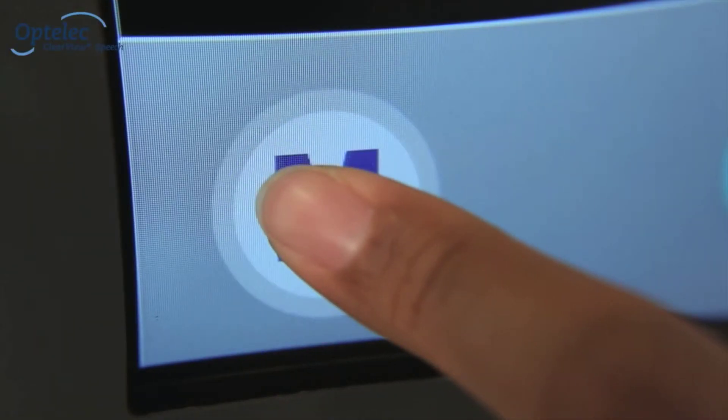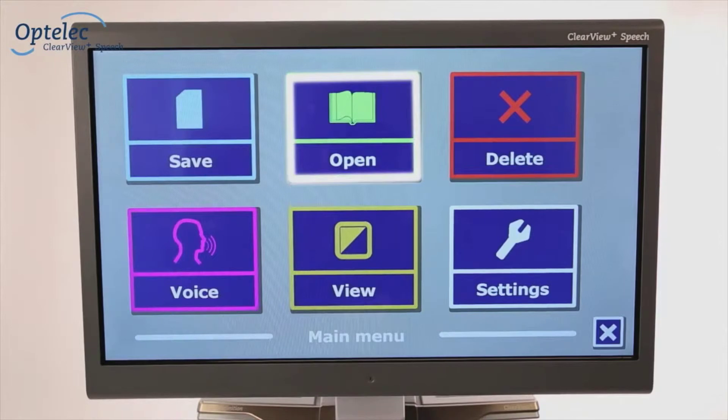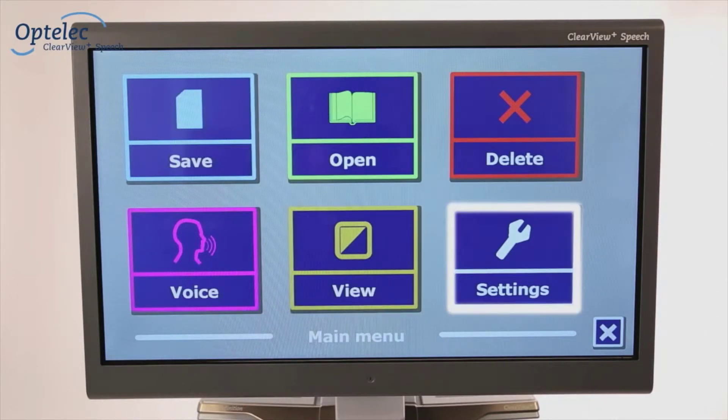The menu allows you to save documents, open documents and photos, remove documents, select a different voice, adjust the color of the text, and change the general settings.